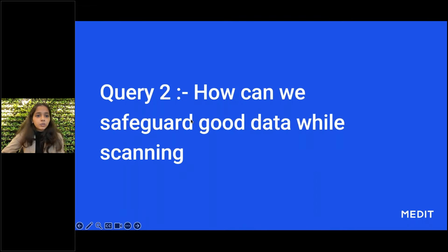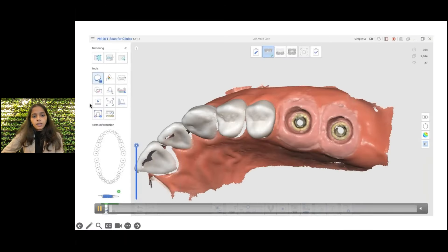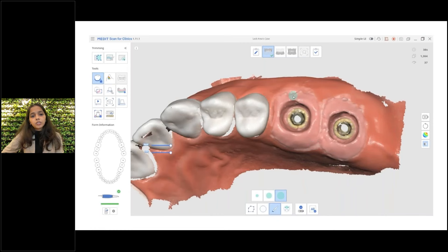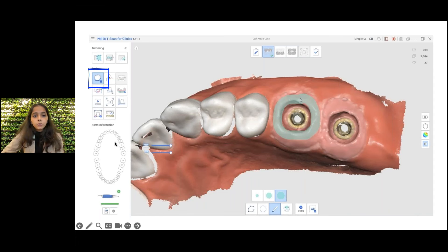So as we discussed, we have talked about the overlapping of scan data that happens due to unstable soft tissues or frequent scanning onto the same area. Although we now know how to edit those scans, let's see how we can avoid that overlapping tissue issue altogether. In this case, I have captured a beautiful emergence profile, and to preserve this I am using the lock area tool to lock that area onto my scan.